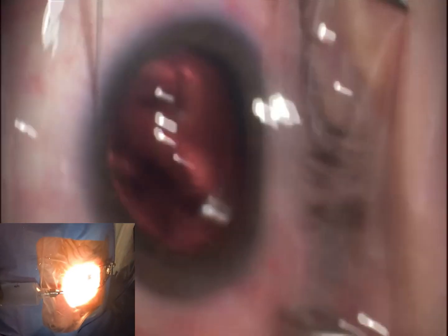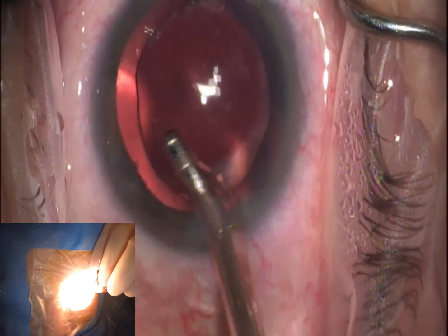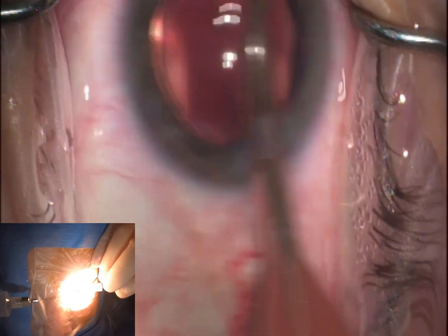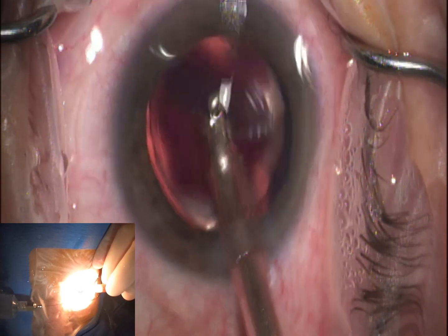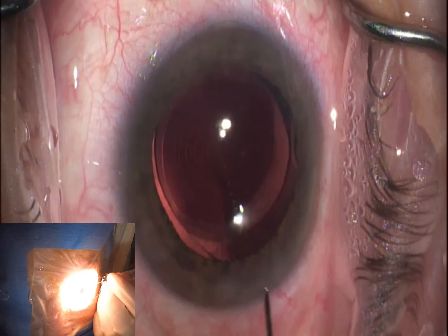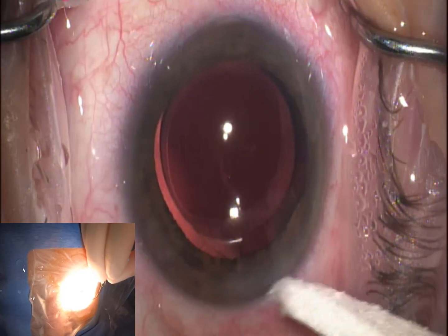Now we rotate the scope and head back up. There was just a tiny little bit of blood inside the eye when I left, so the chances of this person having a lot of blood efflux is relatively low. As you're cleaning out all this viscoelastic, I always recommend giving the patient a heads up — they have a much easier time tolerating blurry vision on day one if you signal ahead of time that it's completely normal and will clear up on its own. When patients do have blurry vision post-op day one from the injection and that little micro-hyphema that can occur, I tell them their eye is functioning like a snow globe: anytime you move around the vision will get blurry, but when you stay still for a period of time it will clear up. It will take about a week or potentially two weeks to fully resolve, but it will resolve on its own. She looks good.